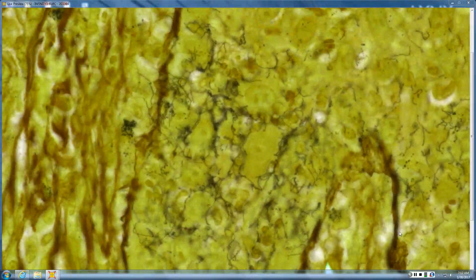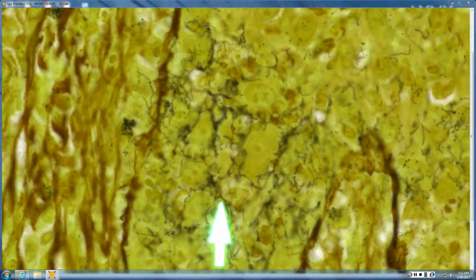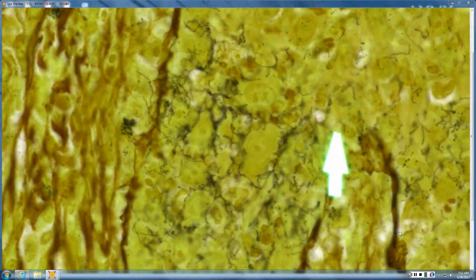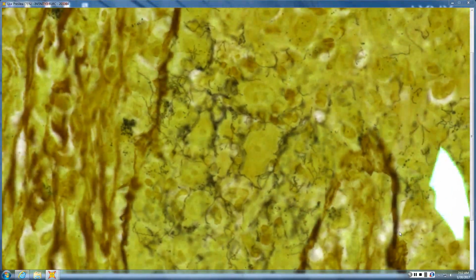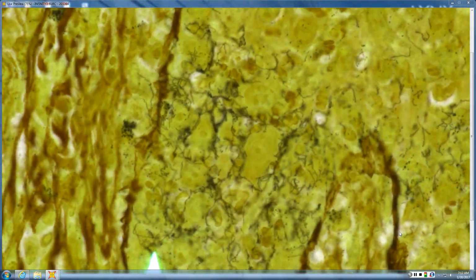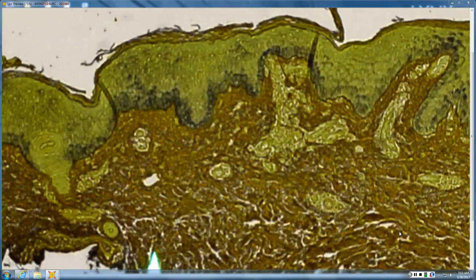and you have to get down really close to see. That's what all these are, all these little organisms. So this one is chock full of them, but sometimes it's not this obvious. It's hard to find them, and they can be very, very vague. But that's what all these are, all spirochetes. I was on 60x. So that's why you have to be careful if you get the slide and you can't see all that darkness and think, oh, that's positive. That's not what you're looking for.